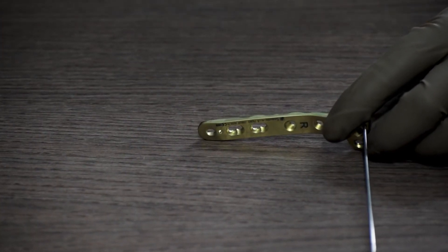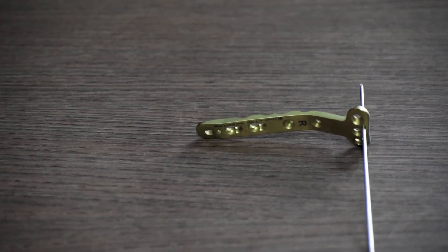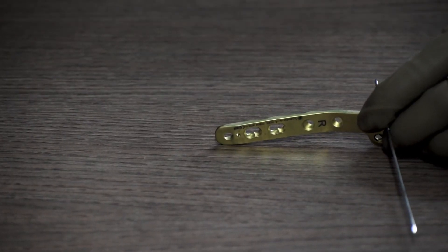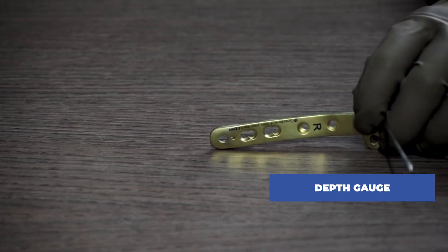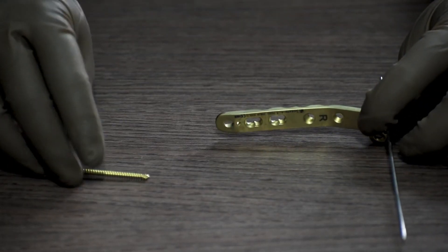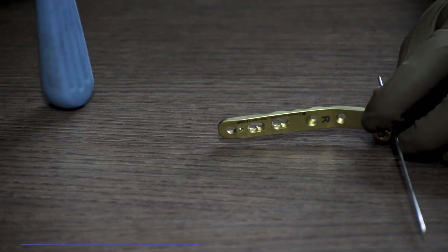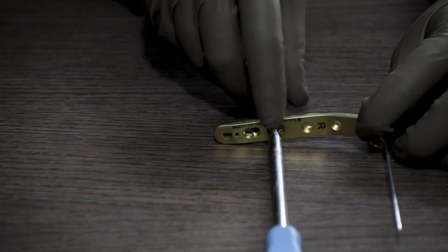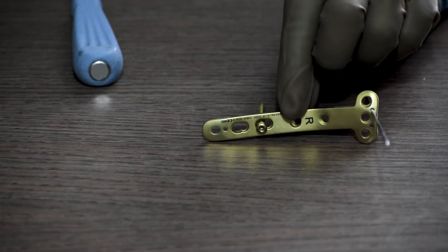Once drilling is done, we remove the drill guide. A surgeon may or may not then use a 3.5mm bone tap to clear the entry of the screw — this step is entirely the surgeon's call. After that, we take the measurement with the depth gauge, take a 3.5mm cortical screw of the measured length, and with a 3.5mm solid screwdriver fix the screw in the non-locking hole. We then remove the K-wire to prevent it from bending during compression.